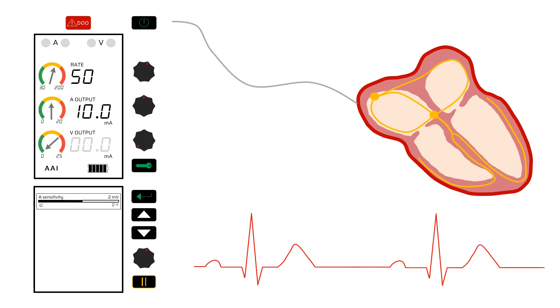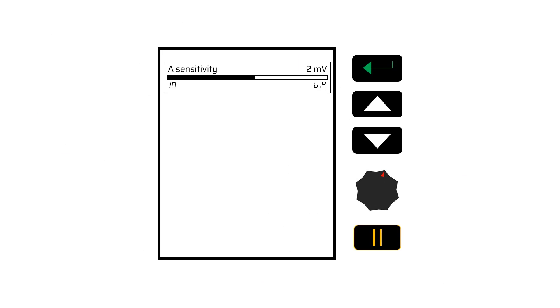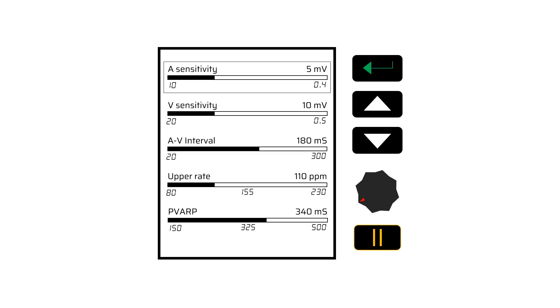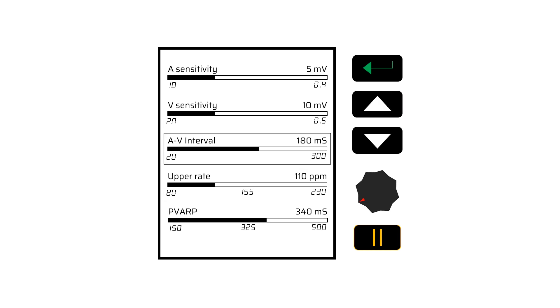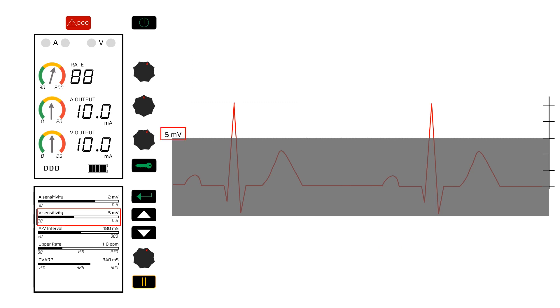We can set how sensitive each lead is at the pulse generator. The units of sensitivity are millivolts, a measure of electrical potential difference. The number we set for sensitivity is a voltage — changes in voltage less than this will not be interpreted as cardiac activity, while changes in voltage more than this will be interpreted as cardiac activity. We can change this setting by using the dial on the bottom part of the pulse generator. Here we have set ventricular sensitivity to 5 millivolts. Any electrical activity less than 5 millivolts will be ignored, and any activity more than 5 millivolts will be interpreted as cardiac activity. The pacemaker is able to sense the QRS complexes appropriately.